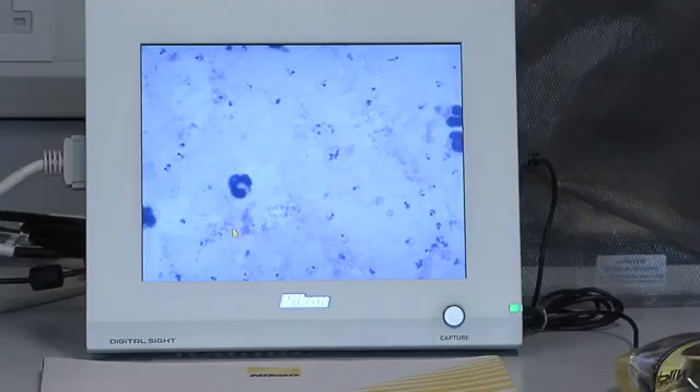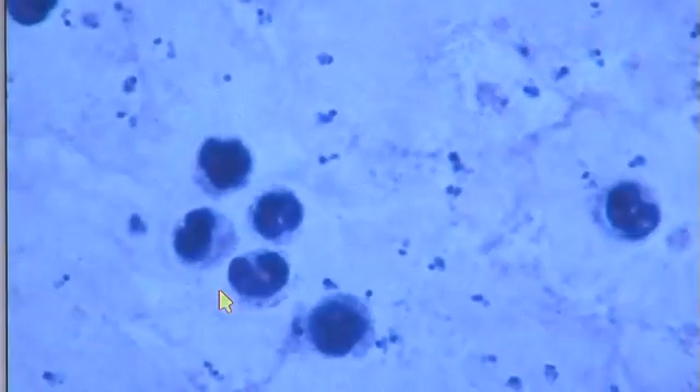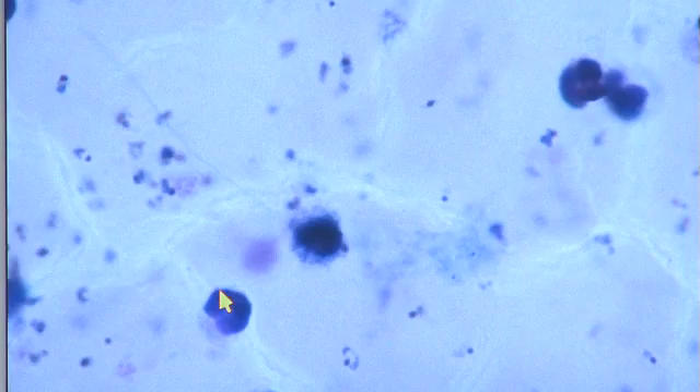On a thick film, as you can see, you can just see the parasites but you can no longer see the red cells that surround them. This makes them more difficult to visualise and definitely to speciate, but you should still be able to do it from a thick film.